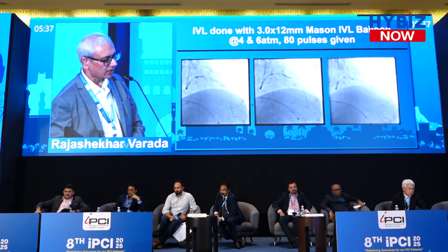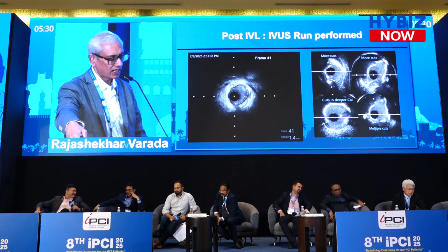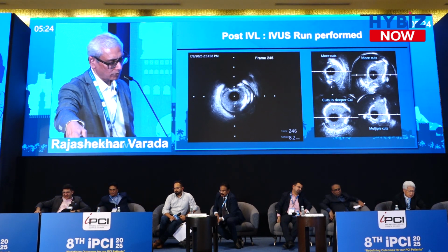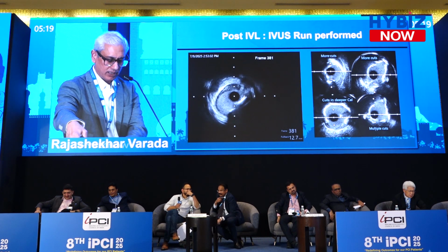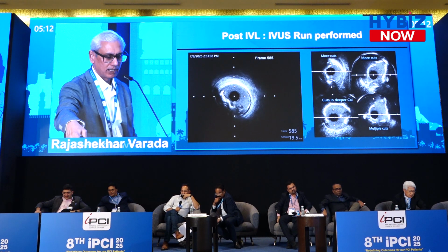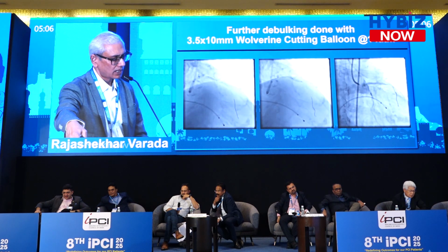So again, I went with another IVL. This time we used the Indian IVL, the Mason Admiral. And after that, we did one more. So we got much better cuts, much better calcium modification. You can see here where there was uninterrupted calcium after the rota. You can see in the right lower panel, it's much more multi-quadrant cuts, much better calcium modification.